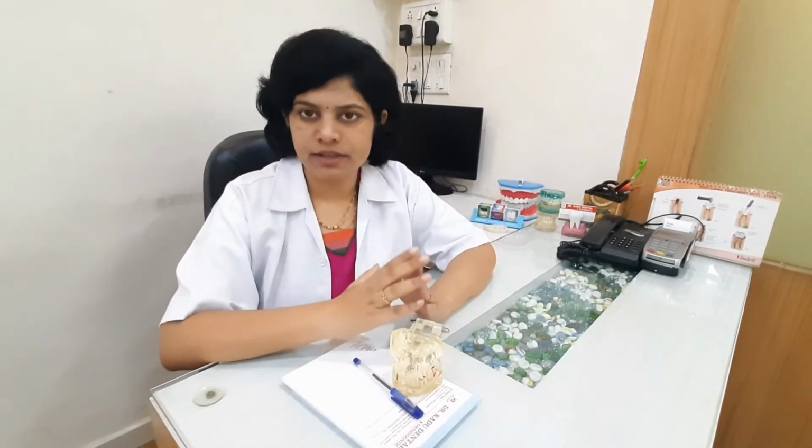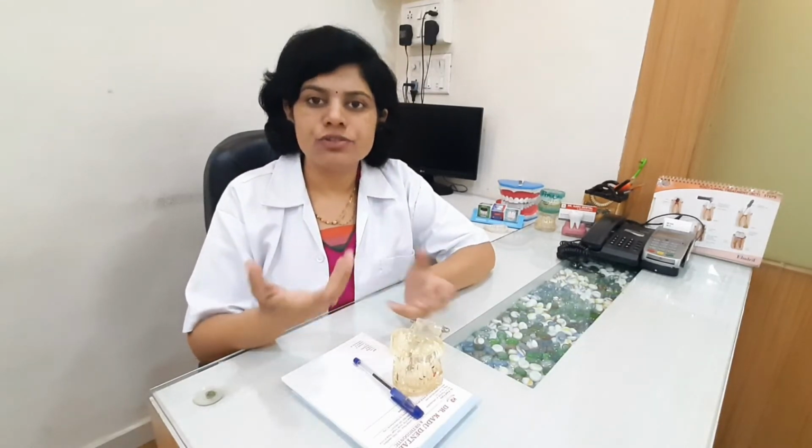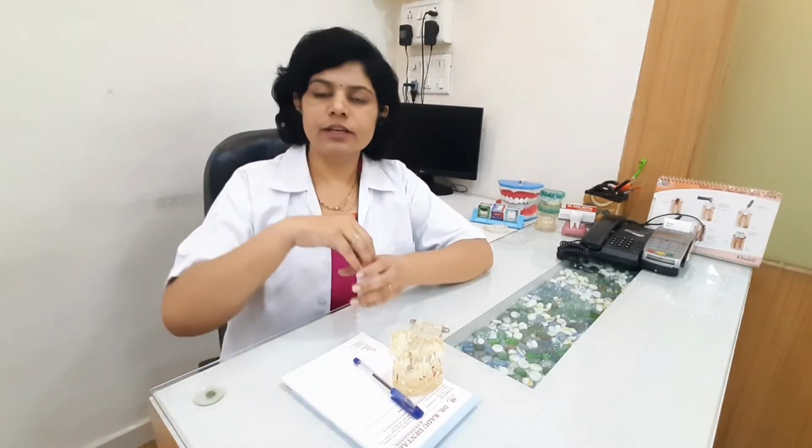So now what is a waiting period? Once we put the implant inside the bone, the implant takes some time for osseointegration. Osseointegration means the implant threads get integrated with the bone. It gets united with the bone properly.